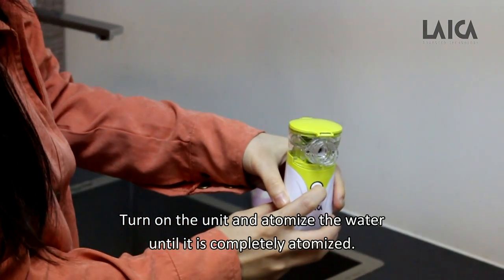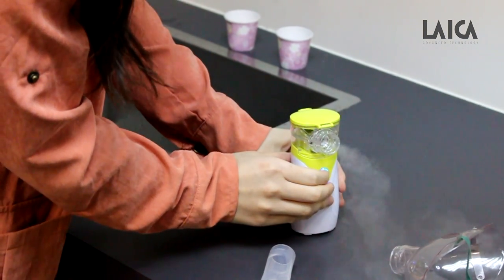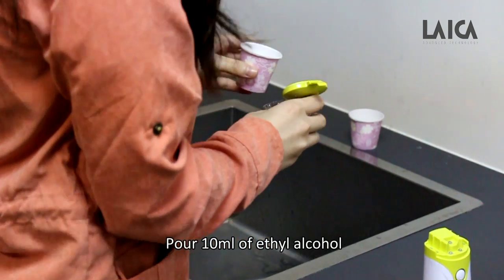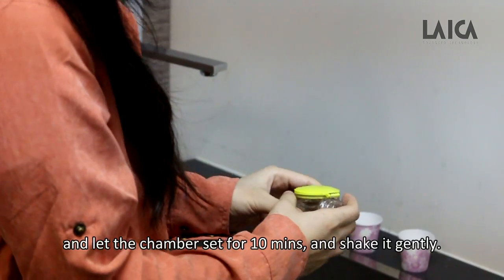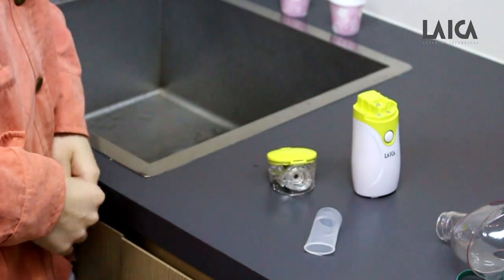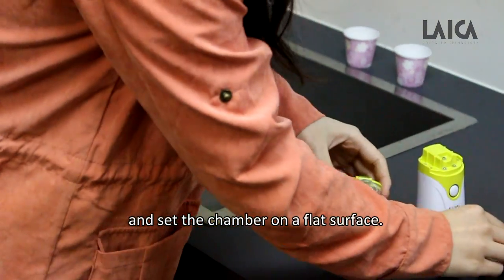Turn on the unit and atomize the water until it is completely atomized. Remove the chamber, pour 10 ml of ethyl alcohol, and let the chamber soak for 10 minutes, shaking it gently. Then remove the ethyl alcohol and set the chamber on a flat surface.